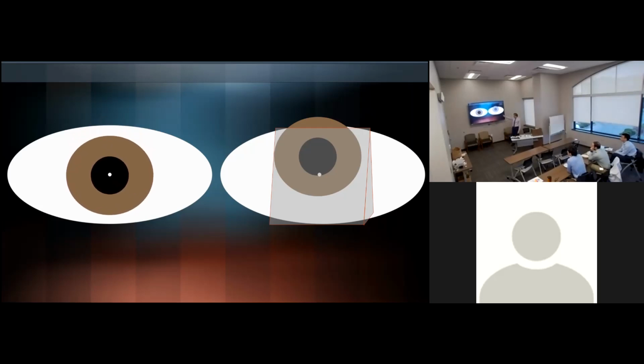Indicating that this eye did recognize the image shift. And the fixation here was central, steady, and maintained. That induced a vertical movement of the other eye. If you switch the prism, for example, and this eye is ortho but has anisometropic amblyopia, the image shift will fall in the suppression scotoma of the right eye, and the eye will not recognize the image shift, so it will not move. So there will be no induced movement here.